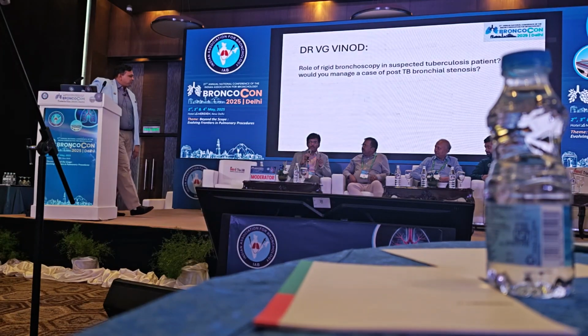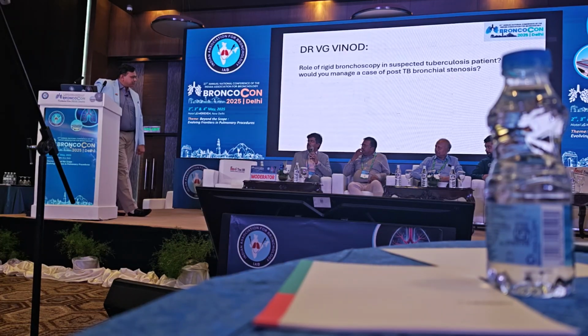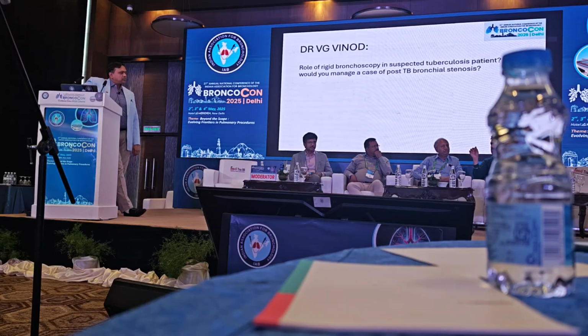So one point I would like to add. One particular patient was referred for bronchoscopy wash who had diffuse nodules, but there was a 2 centimeter node. The node sampling eventually turned out to be malignancy, and it would not have been sampled otherwise. So I would encourage all the people to specifically sample the node. Even if conventional TBNA still has a role, we definitely have to think about sampling the node. If the depth of the node is not too much, we can easily go by the conventional angles.